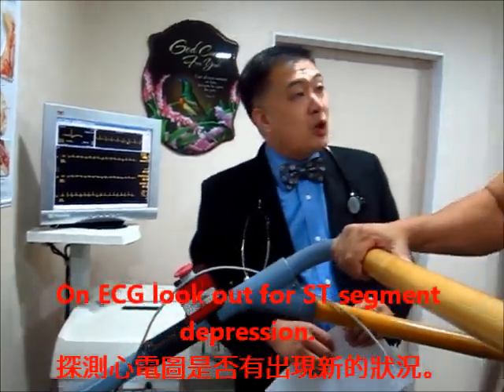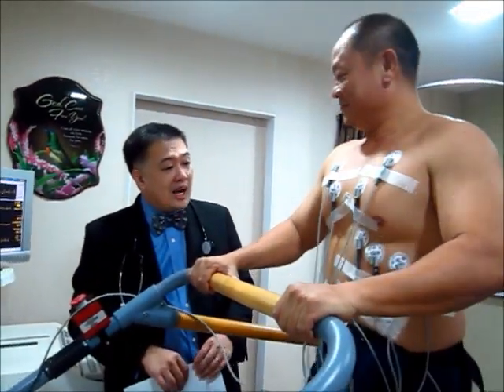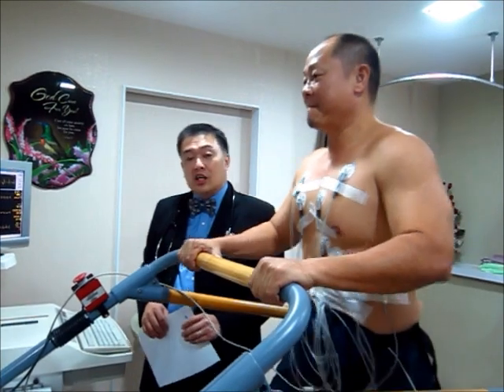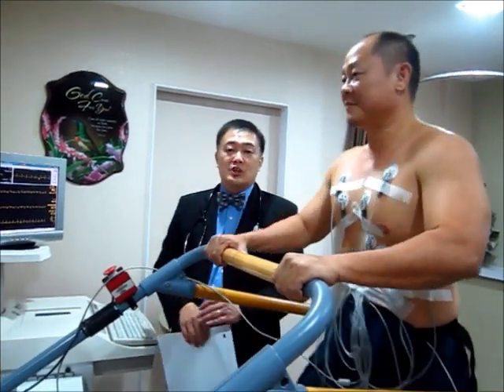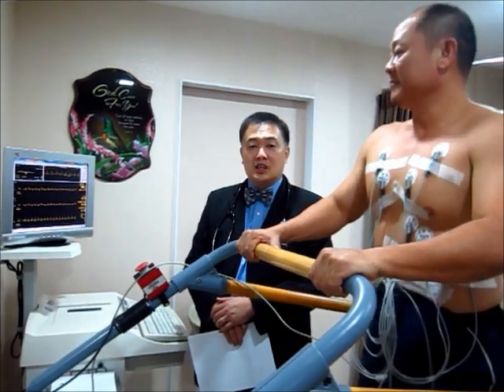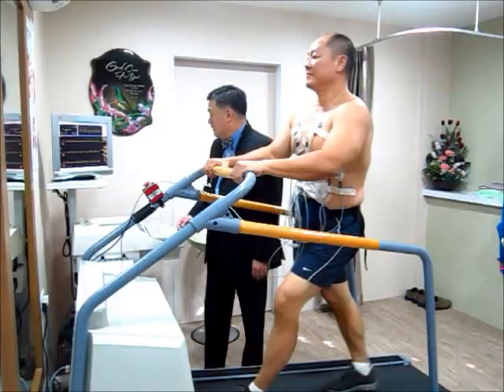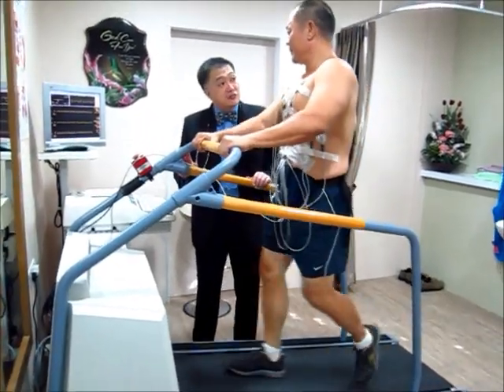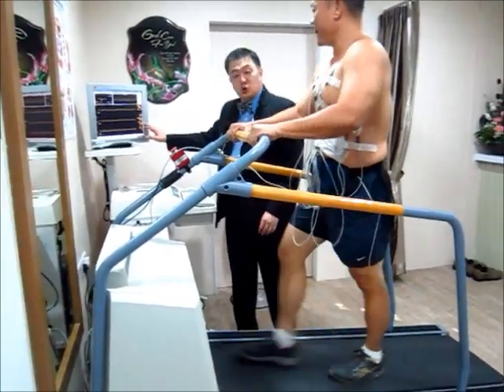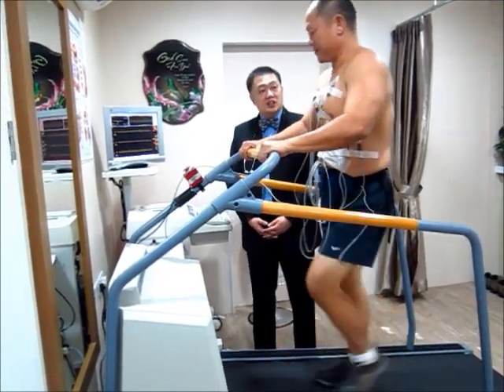Mr. Koh, are you feeling alright? Any problem getting breathless? How are your legs? Excellent. Mr. Koh is feeling perfectly fine and can cope with this level of stress, so I want him to continue with the treadmill. Mr. Koh, in another 15 seconds you will finish stage 2 — the machine will rise and the speed will become faster.